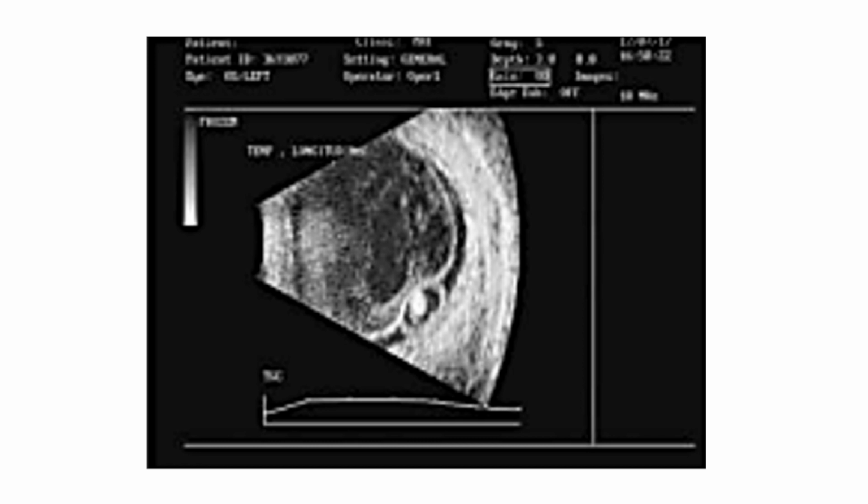I'm sorry for the poor quality of the image, but the ultrasound showed that the vitreous cavity was filled with low to moderate reflective dot echoes. Along with that, there is a high reflective membranous echo posteriorly, and there is a high surface reflectivity cystic echo subretinally, along with a high reflective clump echo within the cyst. So this was suspected to be cysticercosis. Subretinally, the cyst is present, and since the inflammatory reaction is there, it was suspected that the cyst is degenerated and a dead cyst.